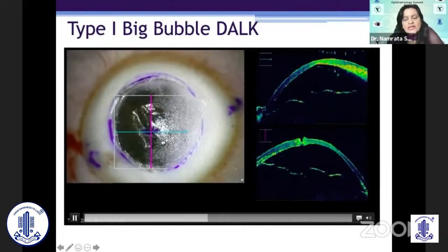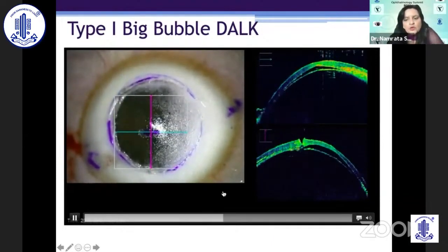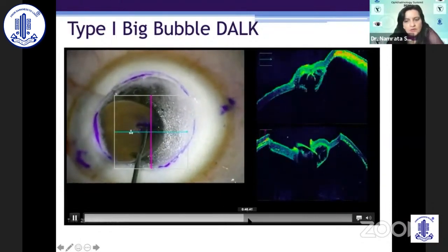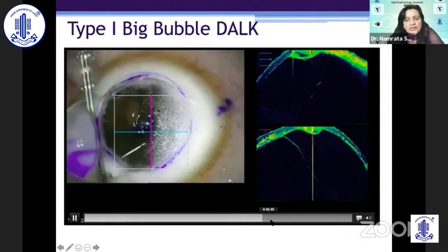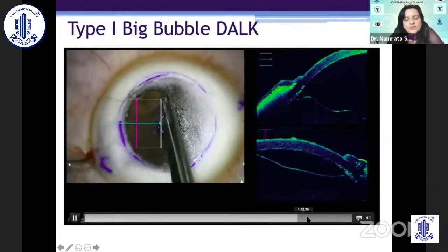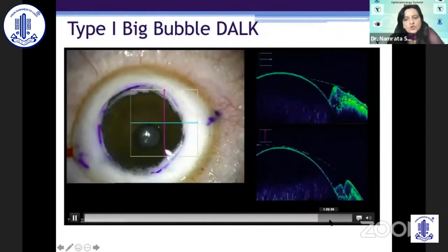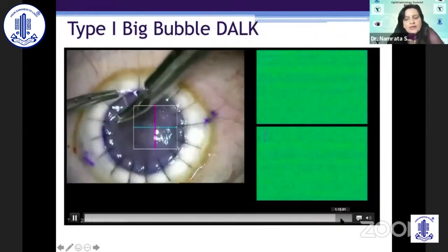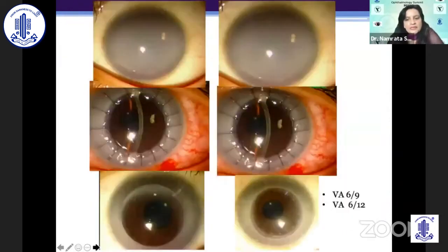So you know that you're still extraocular. You've not penetrated or perforated the Descemet's membrane. And after this, it is reinforced with the help of viscoelastics. So like a kangaroo's pouch, it moves at the back, and then the overlying stromal layers, which are diseased, are removed. And this is the bare Descemet's membrane, which is actually looking at you, so beautifully seen on the intraoperative OCT microscope. And then one can suture the graft in place.